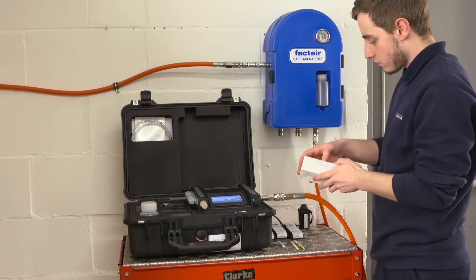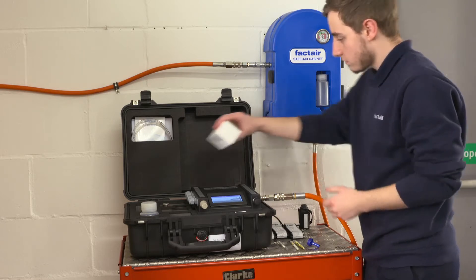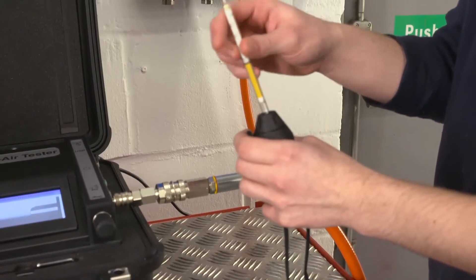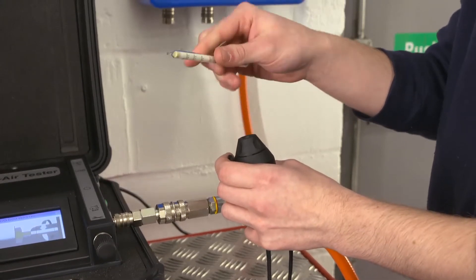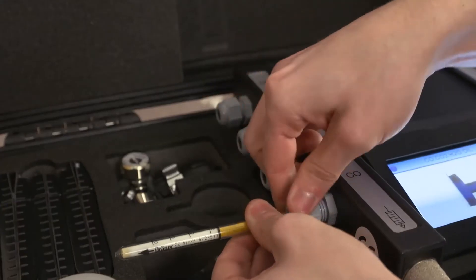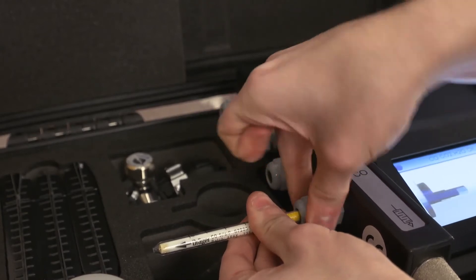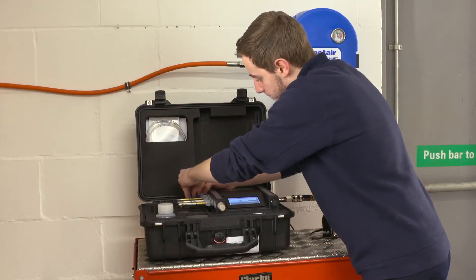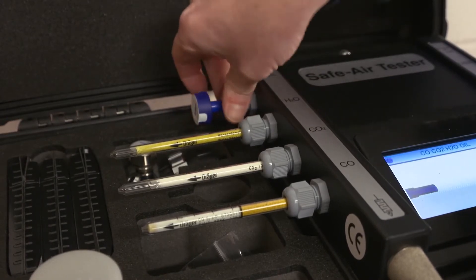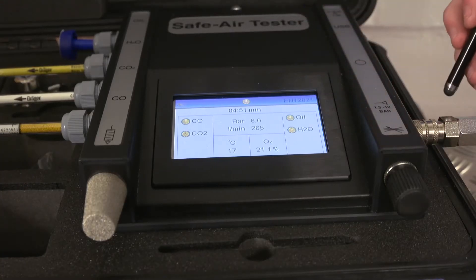Once the purge has finished, the Draeger tubes can be prepared for insertion. Remove both ends using the cutter provided — this ensures a clean cut is made and that glass fragments do not fall into the tube ports. The Draeger tube tip cutter has three cutting blades; insert the tube into the hole, gently rotate, then rotate the tube to the side to break the tip. The tube tip will be retained within the cutter for later disposal. As each tube is prepared, it should be inserted into the relevant gland with the arrow pointing away from the unit and tightened firmly. The impactor should be inserted into the oil port, with the protective seal intact. Once the tubes and impactor have been inserted, press the arrow key to start the test.